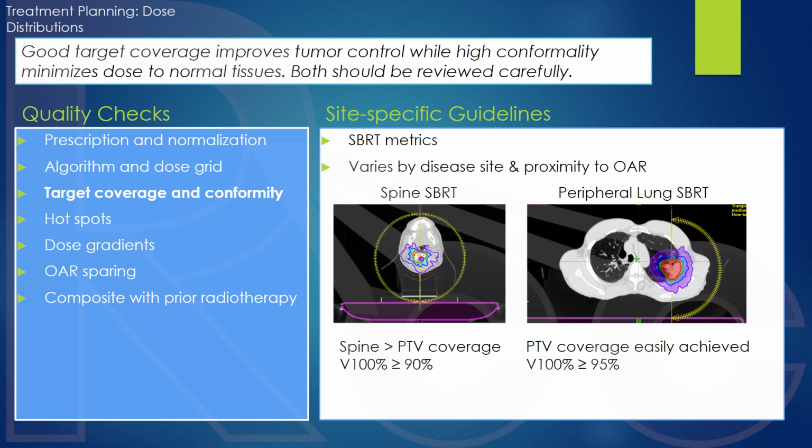Paddick has the additional built-in check of the spatial overlap, so in that sense, it's a bit more robust. What I mean by that is that if we use the RTOG definition, then we could have an isodose line that perfectly matches the shape and size of the target, but does not overlap it and have a very good score. Now, if you're using normalization appropriately and it's a good plan, then there should be good plan quality from using the RTOG metric for evaluation.